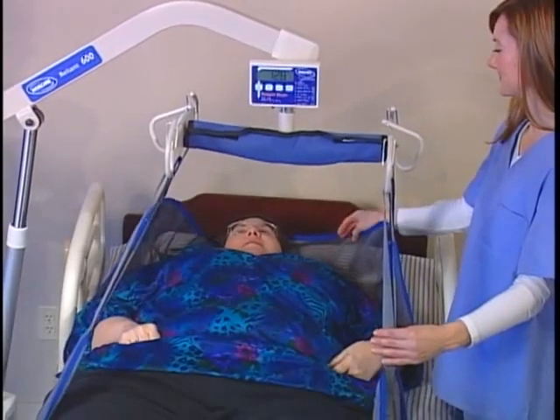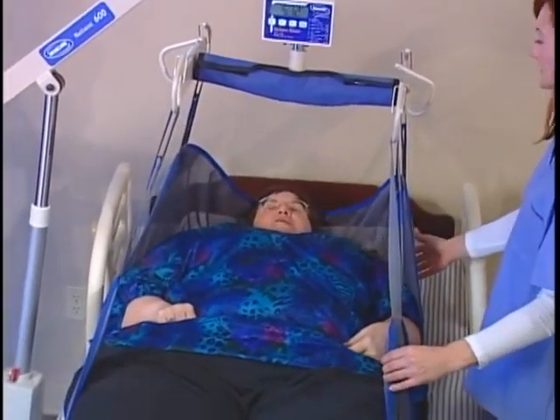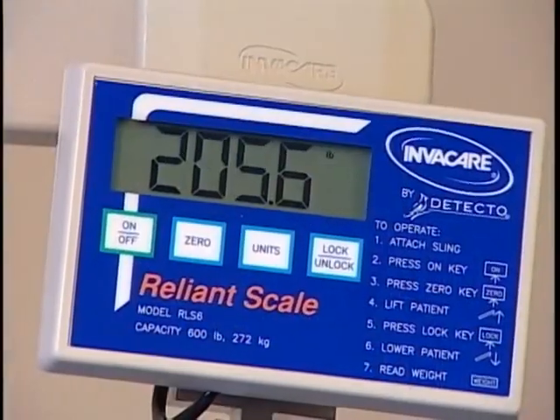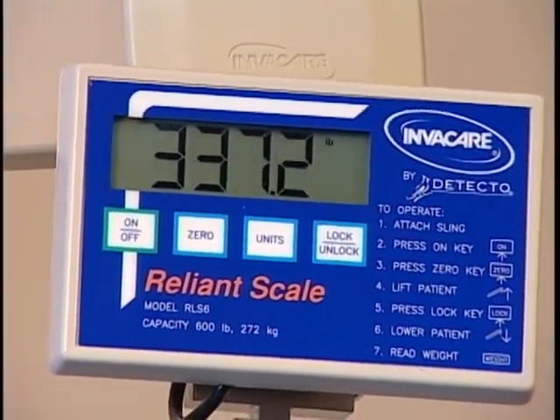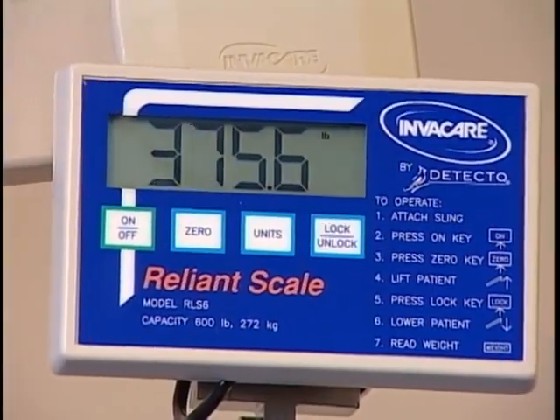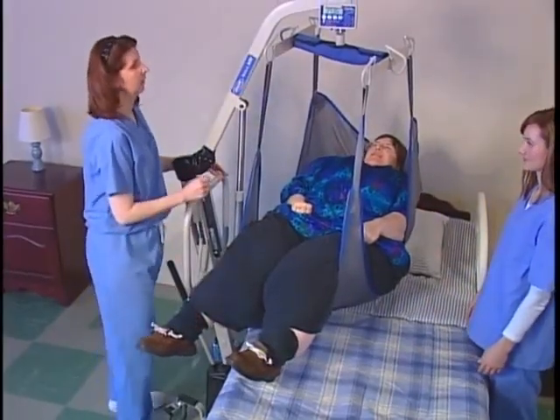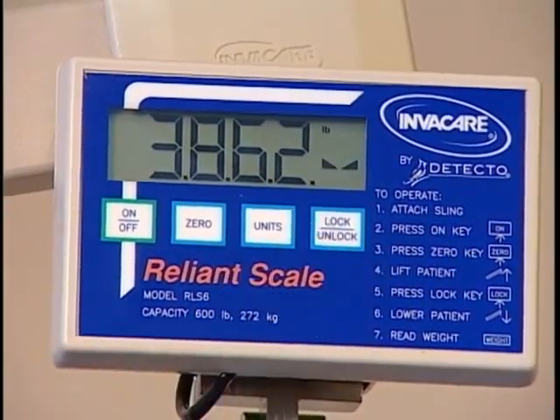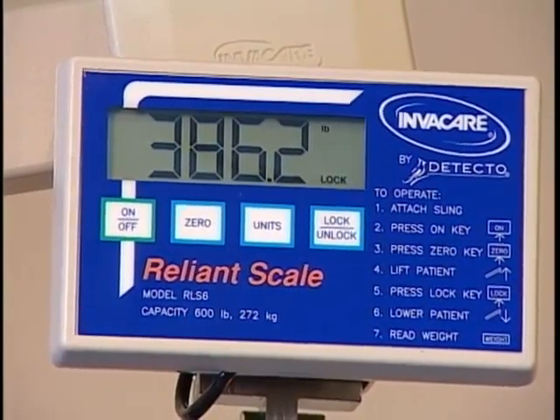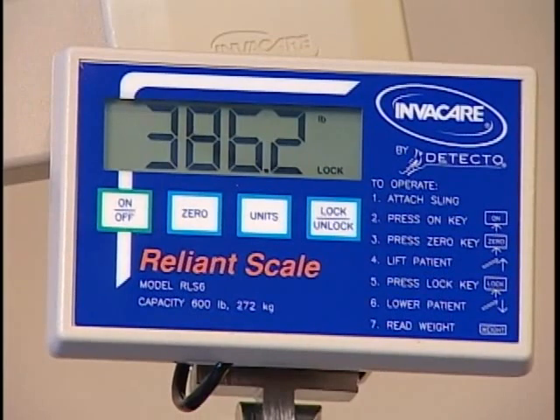Place the resident in the sling and raise them so that their weight is fully supported by the lift. The scale accurately measures the weight. It's normal for the reading to fluctuate for a while during this process. When this fluctuation decreases to a rate of about two-tenths of a pound, press the LOCK UNLOCK key to lock the weight display.